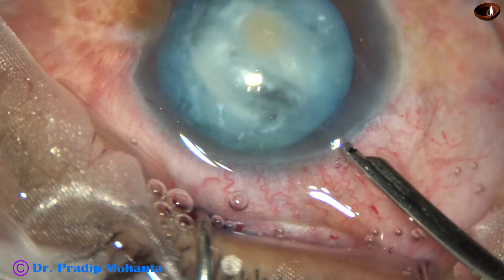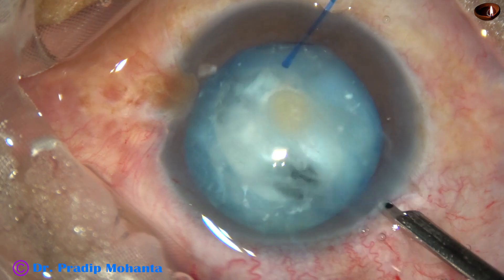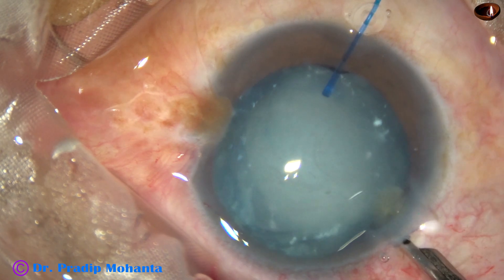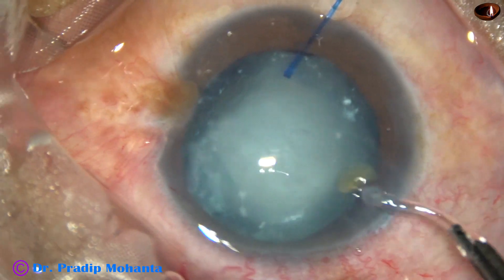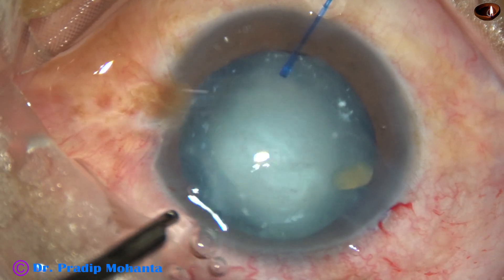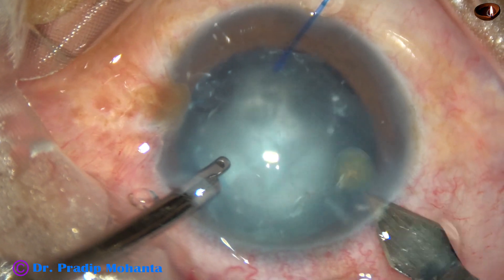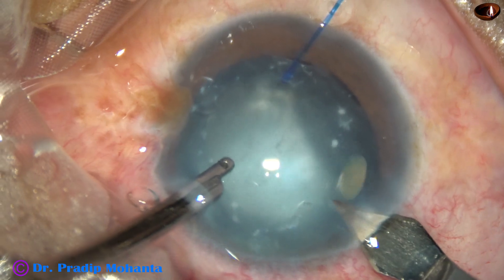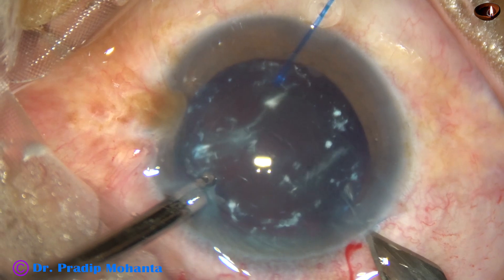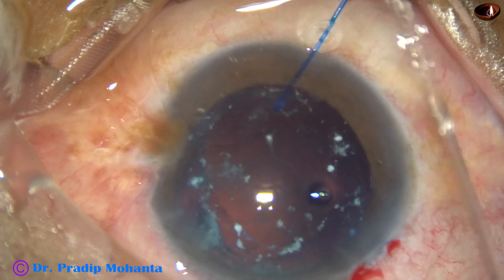That brown small thing is the nucleus. Everything has turned into a milky fluid in this case, and this is a very tiny nucleus. I put irrigation through the left side port, take the keratome, depress the posterior leaf after making a small cut, and it comes out. Depress the posterior leaf and the whole milky fluid comes out. In this case, I don't find any cortex.